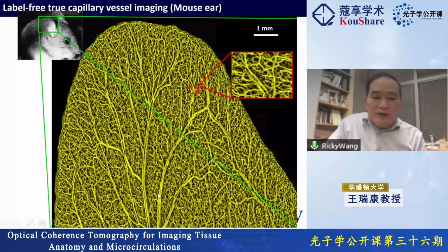So for example, if we cut this main blood vessel over here, one intuitive thought is that because this vessel supplies all the downstream areas, if you cut this, what would you think?